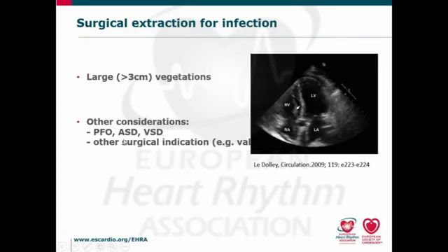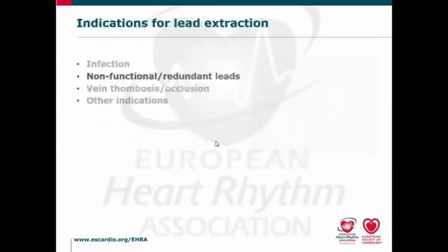And sorry about this, somehow it didn't come out very well with the file, but if you have another surgical indication, say the patient needs to have a valve repair at the same time, then obviously it's much easier for the surgeons to take the lead out at the same time.